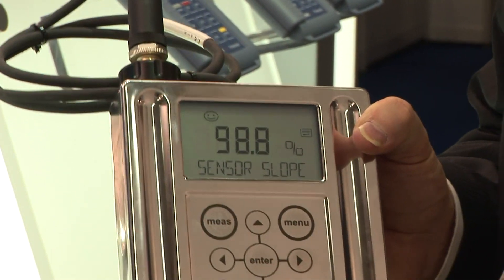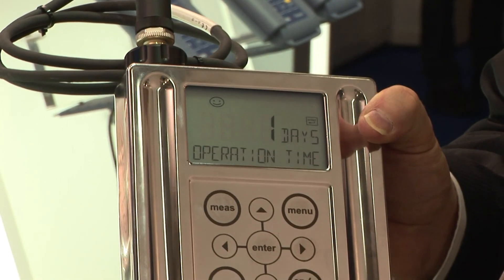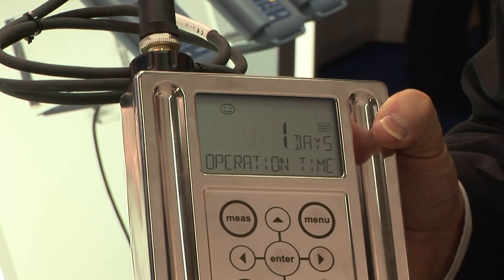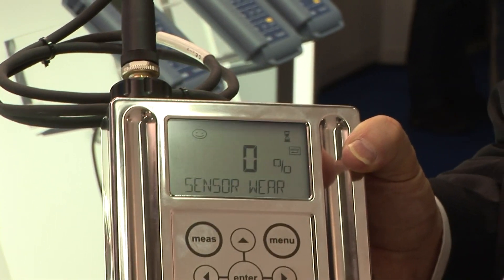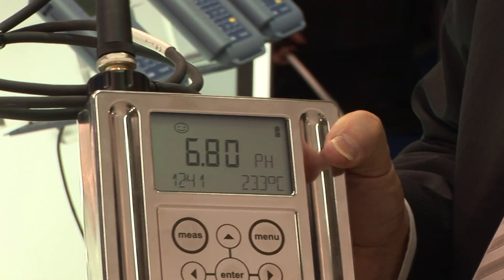You can go right to the place where your pH electrode is installed and do an in-place calibration, checking whether the sensor and the chemicals are all correct.